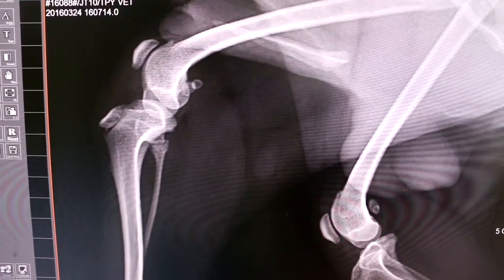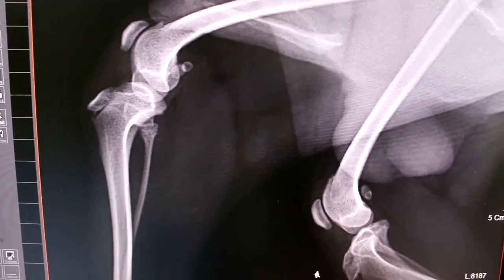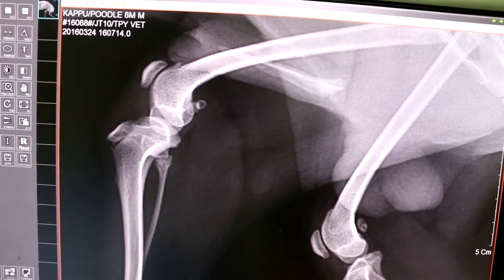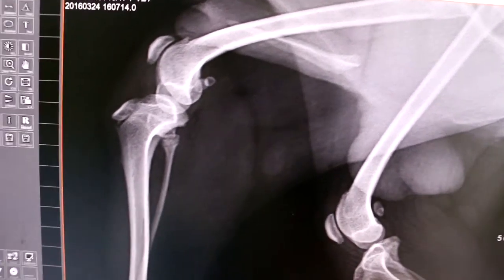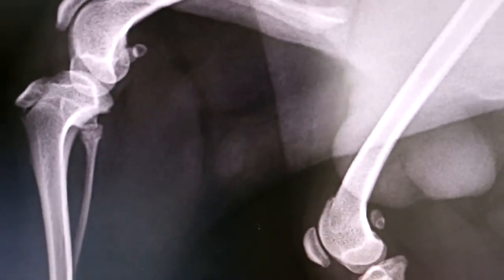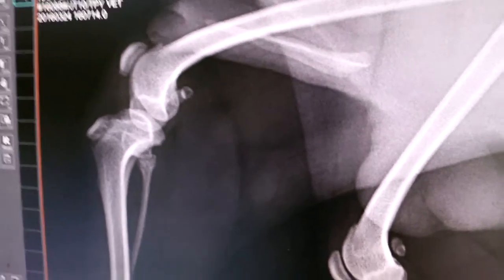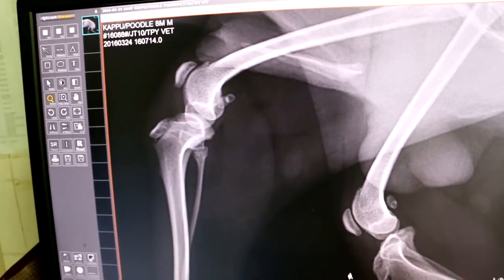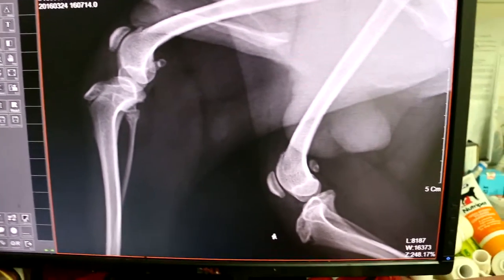So this is a perfectly normal leg. How many views did you take? One. See whether medial or lateral — it's lateral patella luxation. Both legs, right? Okay.